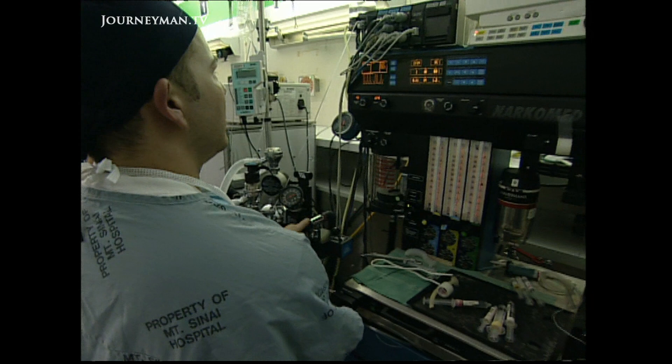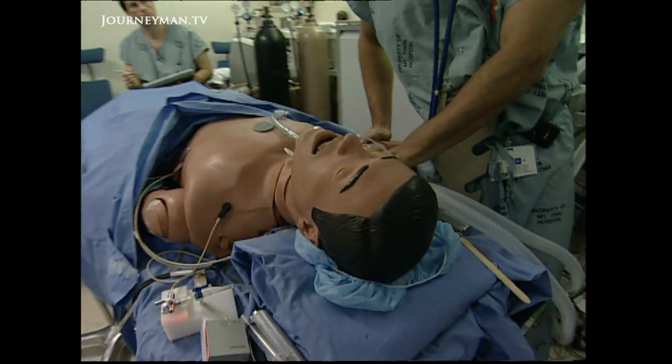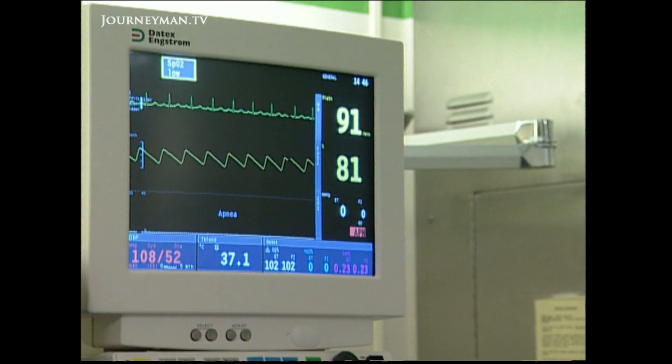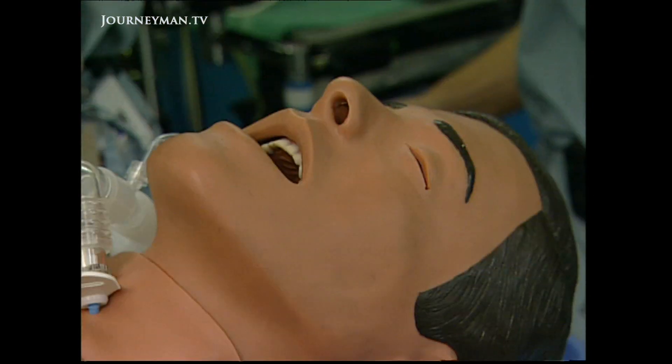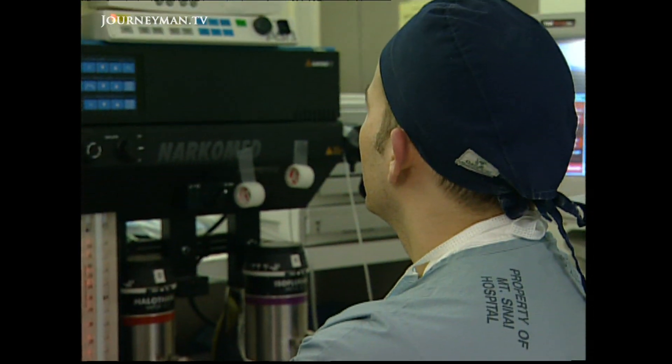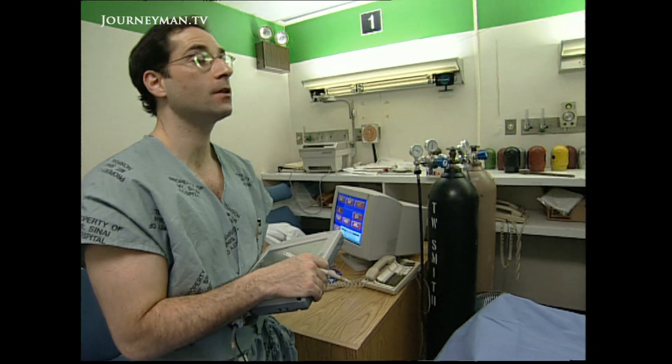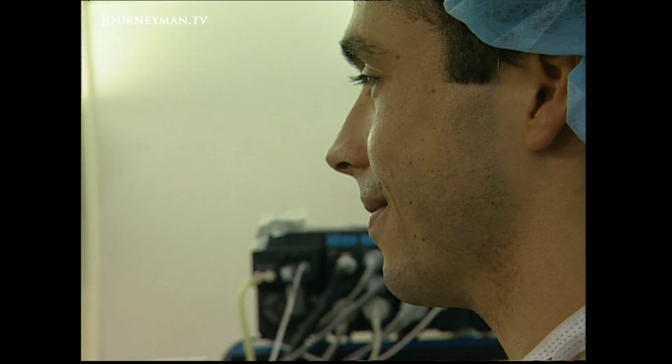It feels very real. Everything that happens in there could certainly happen in the same sequence in the OR, and it's as real as I want to make it — I treat it as the real thing. At this point, if we get him back like this, I would wake him up. He does wake up and he's completely neurologically intact. He says his chest hurts and his throat hurts a little, but he does wake up neurologically intact. And he wants you guys to be his anesthesiologist when he comes back to the OR the next time.